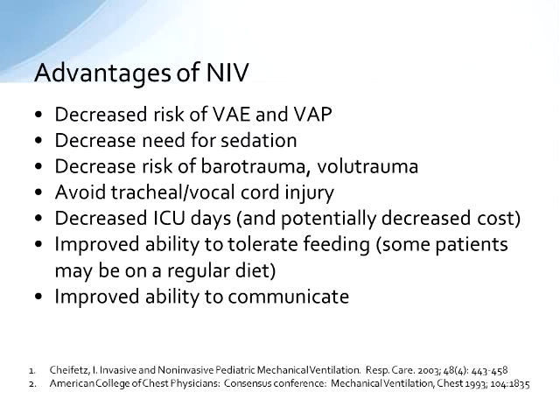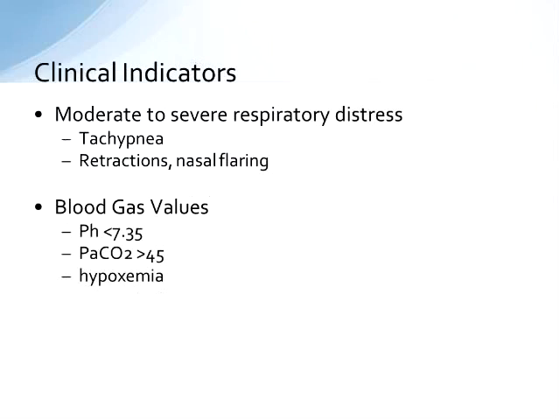So intubated patients are forced to scribble down and write us notes if they're able to do that. Of course, that's not really possible in a 3-year-old that can't write, but they're able to communicate to us in ways that they never could with an endotracheal tube on, so we would know exactly what that child is trying to convey to us. I think this is really important in adults, but this communication piece becomes absolutely paramount for our little guys who don't really have any other means of communicating, whereas our adult patients, in a lot of cases, can write us notes when they're with it enough to do so.